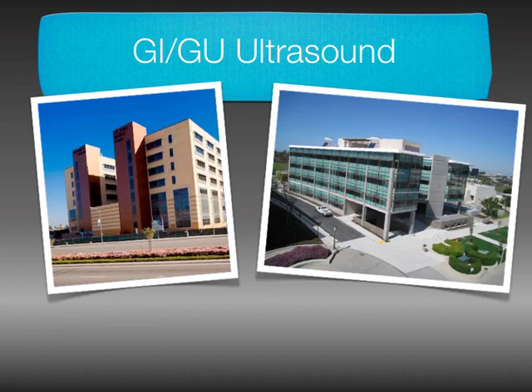Okay, we're going to talk about GI and GU ultrasound today, and the goal, of course, is to try to get you as prepared as possible as we transition from the building that we're currently in here, and as you move from the second year into the third year, which is this building over here, which is the hospital, obviously. And it's not just that building, it's also clinics and wards and the VA and all these other places in Long Beach and stuff. But that's the concept, going from the classroom to the patient, and that's where this ultrasound stuff fits in.